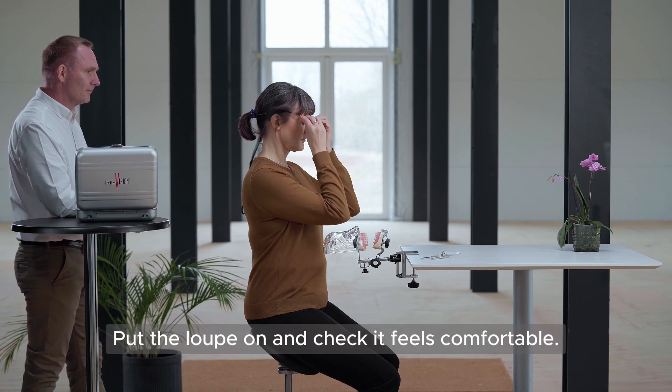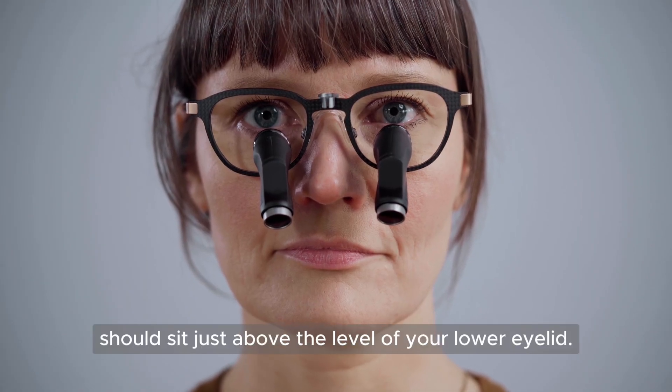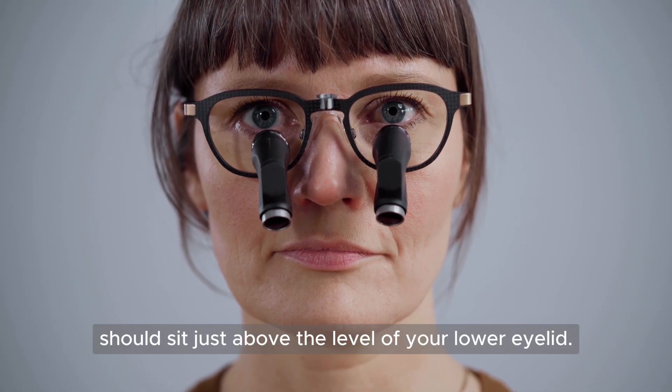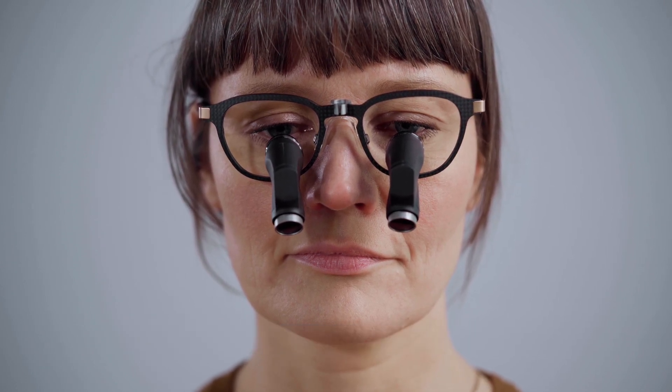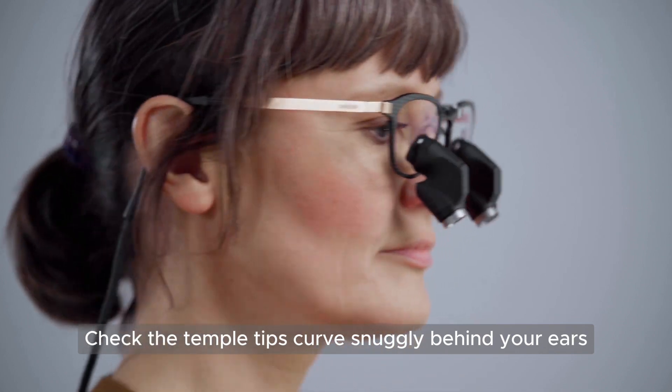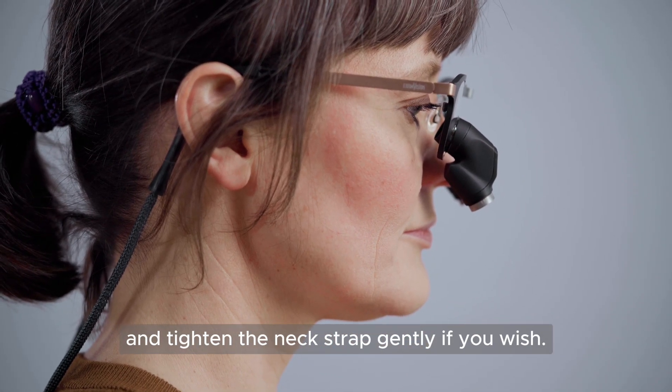Put the Loop on and check it feels comfortable. The oculus should sit just above the level of your lower eyelid, and the nose pad should make full contact with your nose. Check the temple tips curve snugly behind your ears, and tighten the neck strap gently if you wish.